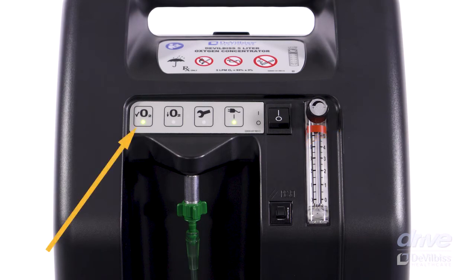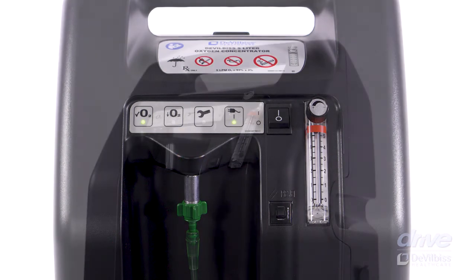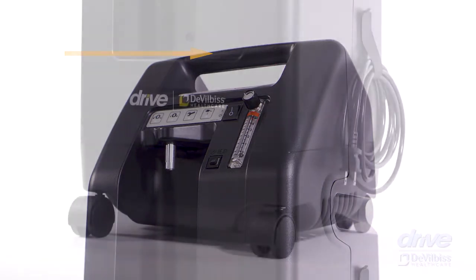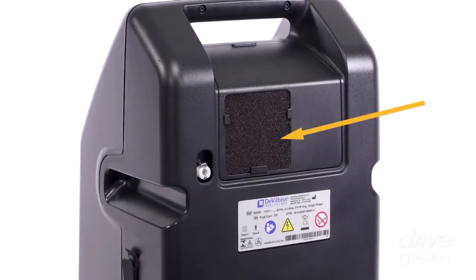Normal oxygen light. Low oxygen light. Red service required light. Hand grip. Exhaust. Power cord. Power cord strap. Air filter. Auxiliary oxygen outlet port.